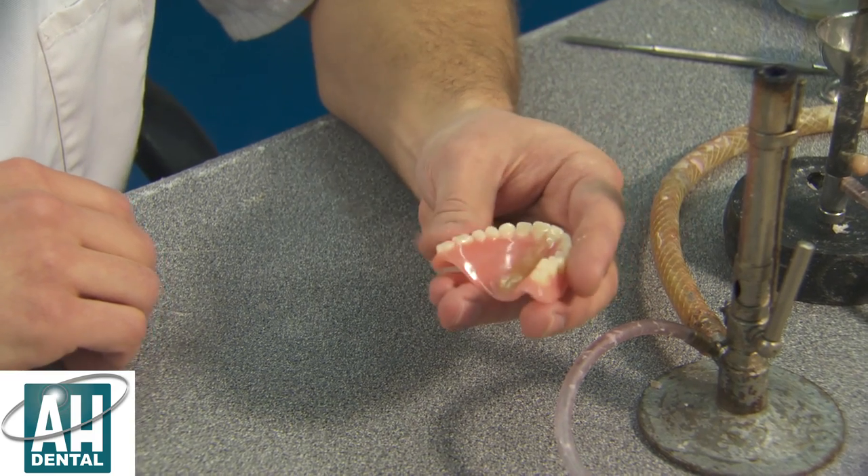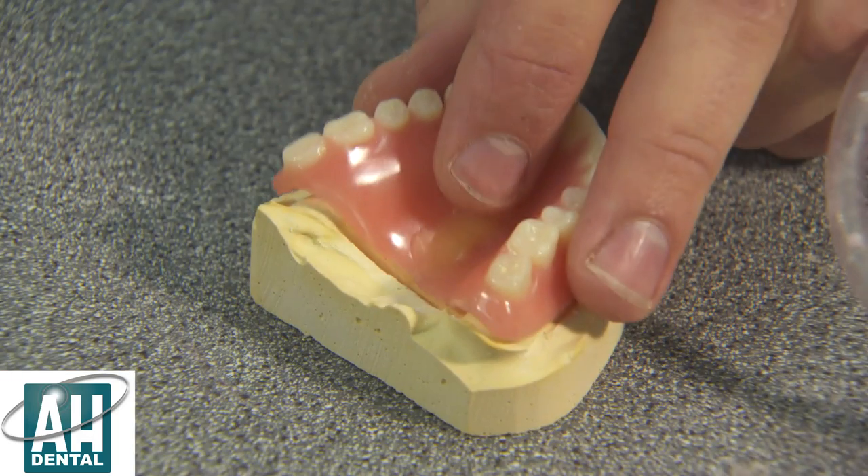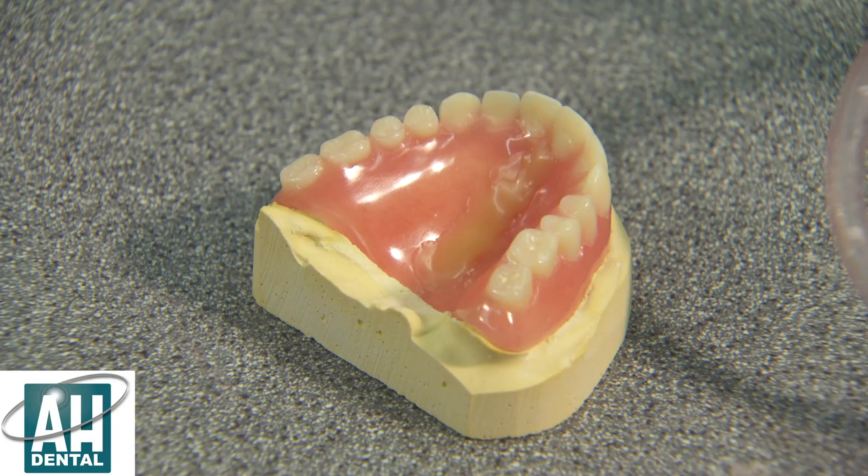We now have to produce a model, but to speed the process up we've already made one, and this denture will fit perfectly on that model.